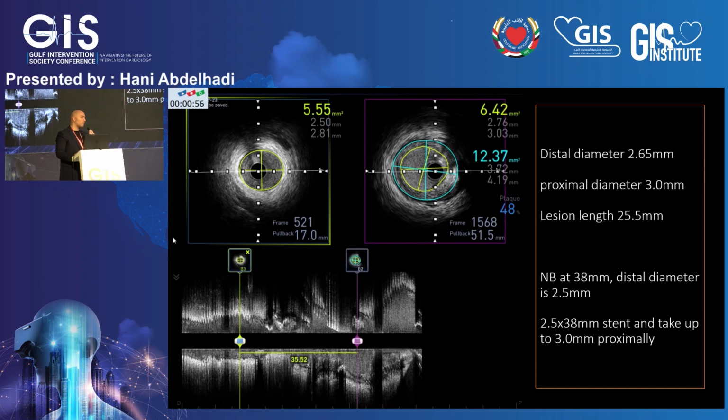Well, the diagonal for us, if you looked at the previous image, the lumen itself is barely 1.8 millimeters. And yes, you can go media to media and upsize it, but distal to your stent, you're going to have a very small MLA in a relatively small caliber diffuse disease diagonal. And the worry here is you can make it look beautiful on the day, but you come back a couple of years later, and is the diagonal going to remain patent or not?